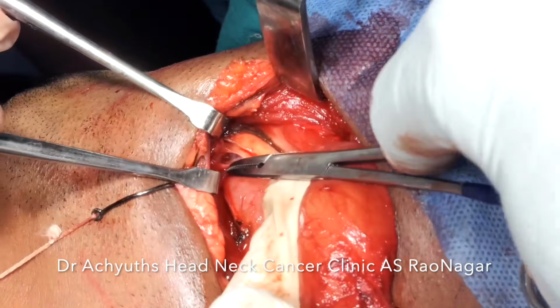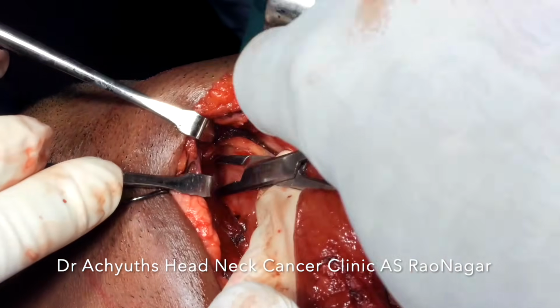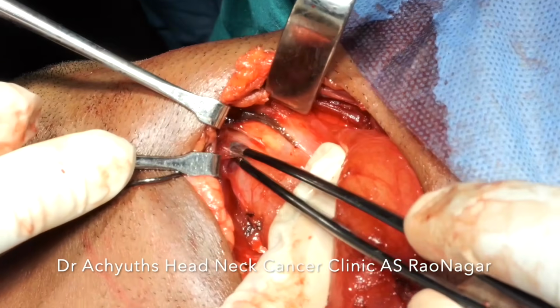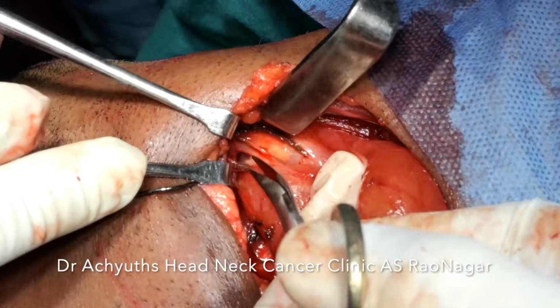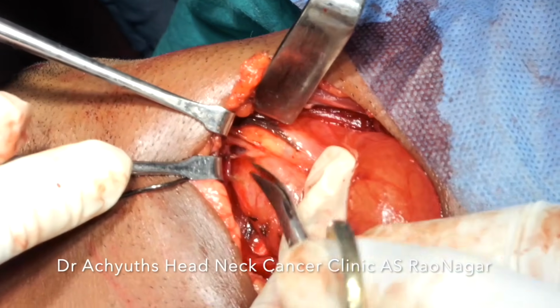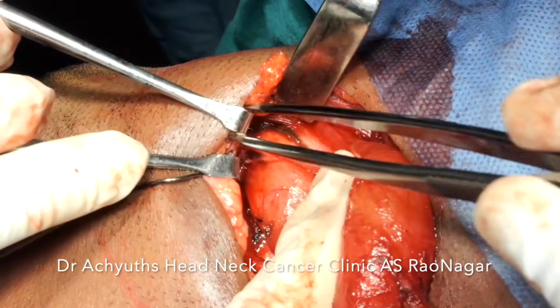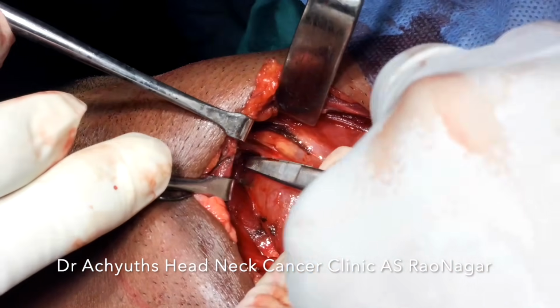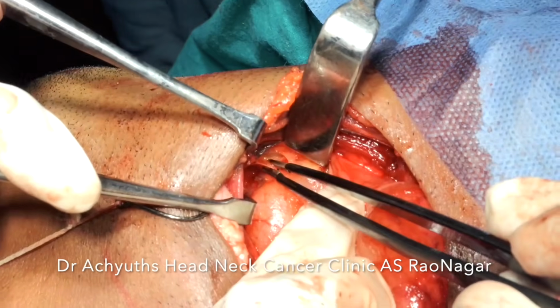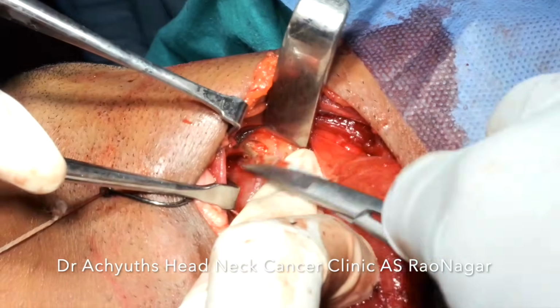The entire cyst wall was conveniently excised even from the endolarynx, from the laryngeal part. Without any difficulty.